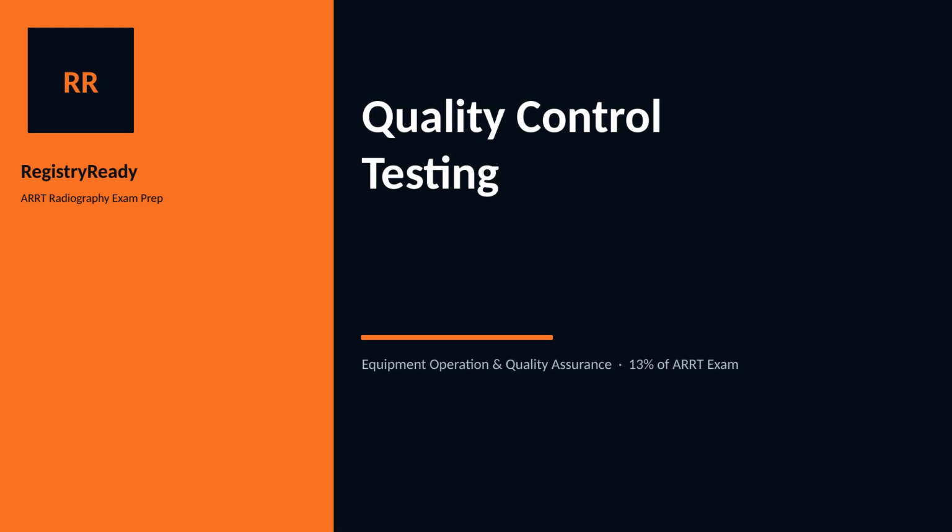Equipment Lesson 7 is Quality Control Testing, 15 minutes and one of the highest yield advanced lessons in the equipment operation category. Quality control is how a department confirms that every piece of imaging equipment is performing within established tolerances, protecting patients from unnecessary dose and ensuring every image meets diagnostic standards.